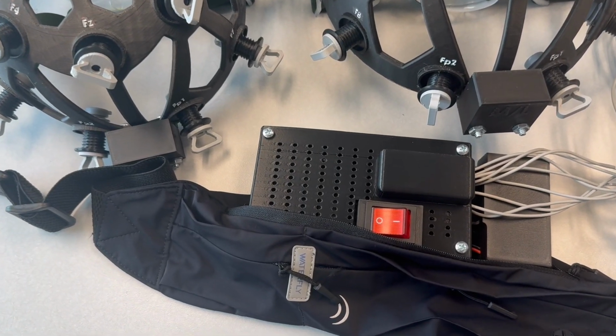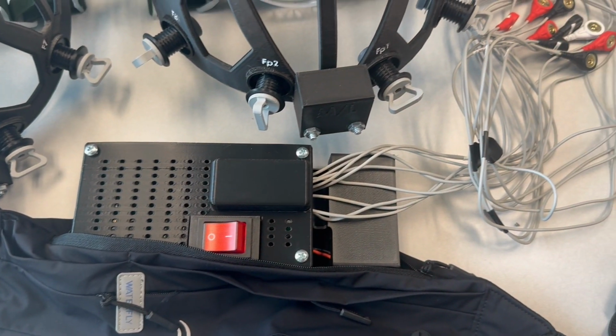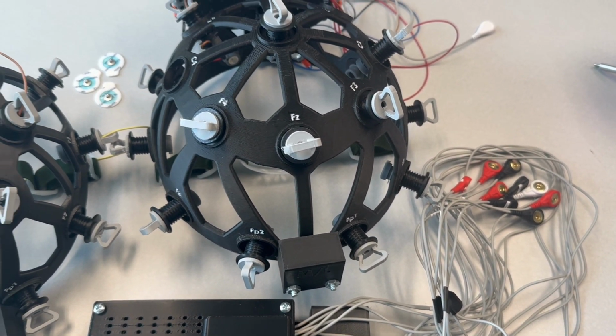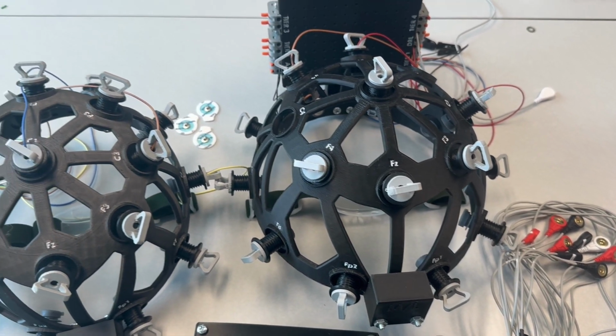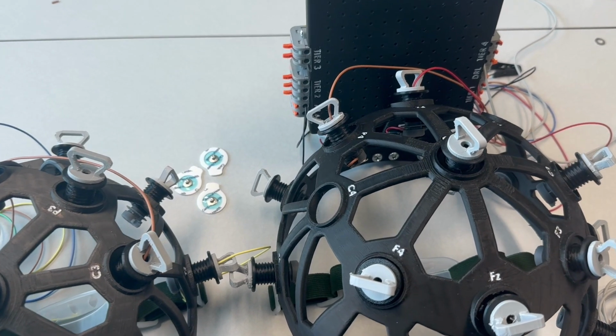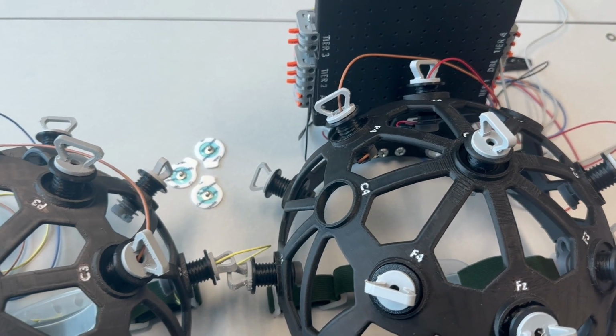The project objective was to develop a system to simultaneously collect both electroencephalograms and electromyograms, which are EEG and EMG data, and wirelessly transmit it to a user interface to be plotted and stored. We were given a budget of $1,500.